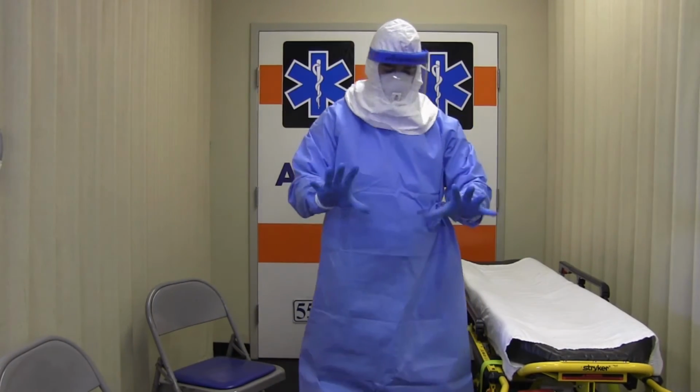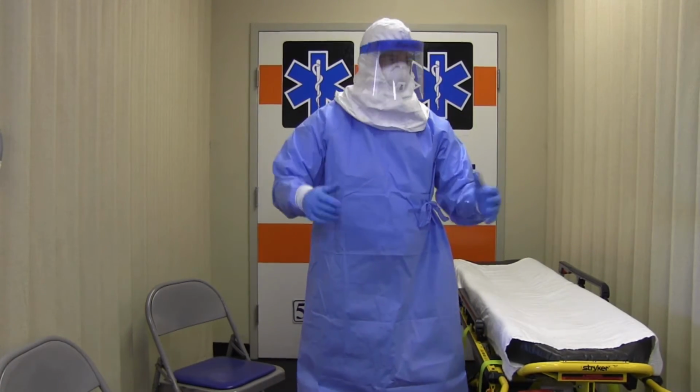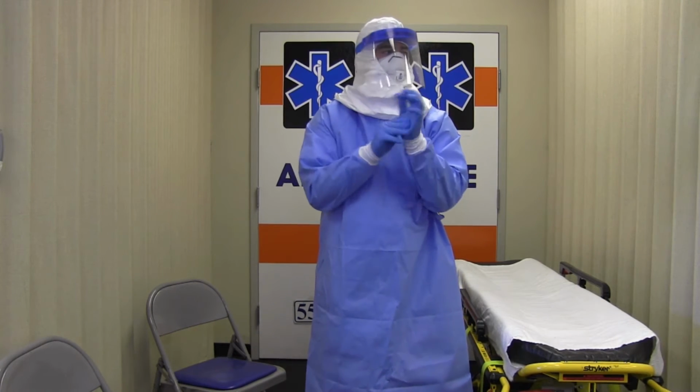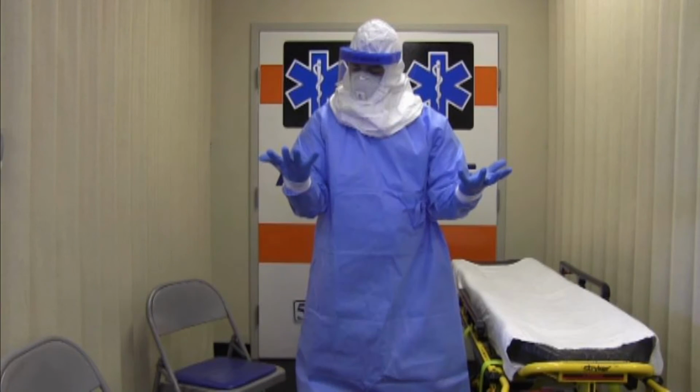Once your outer gloves are removed and discarded, you will then inspect and disinfect your inner gloves. Inspect the inner gloves' outer surfaces for visible contamination, cuts, or tears. If an inner glove is visibly soiled, cut, or torn, then disinfect the glove with an alcohol-based hand rub, remove the inner glove, perform hand hygiene, and then don a clean pair of gloves. Otherwise, just disinfect the inner gloves with an alcohol-based hand rub.